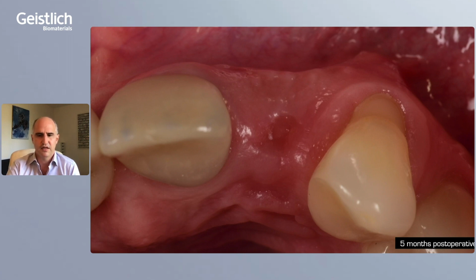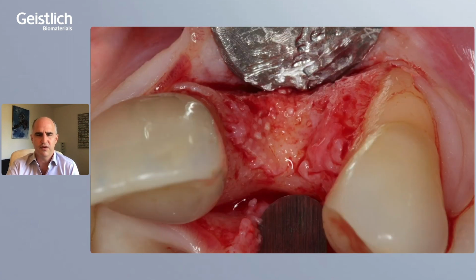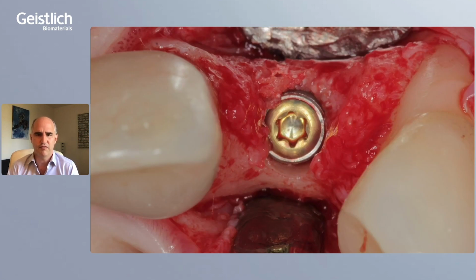You have a thick soft tissue. And of course, if you elevate the flap, you have a nice regeneration of the ridge. Just remember how much loss there was, but of course, the ridge preservation procedure was able to attain an adequate amount of bone. And of course, it was not a big issue to place the implant here in the right position, in the right prosthetic position in this context.